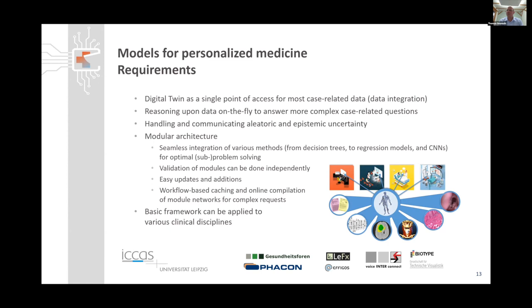Not for the digital twin. Of course, we have it if we apply the digital twin for therapy support. I showed you one of the video sequences for the intelligent operating room, for instance, if you insert an endoscope inside of the patient's nose, and you go too deep, then you have a danger to end up in the brainstem. And shortly before, if it's detected that the instrument is near to this thin bone wall that protects the brain, then automatically the surgeon gets the position of this tool, so that he knows, okay, now I need to be aware. And there, of course, if you have a reconstruction error of your virtual model of the patient that deviates from the physical patient, then you have, of course, a problem.